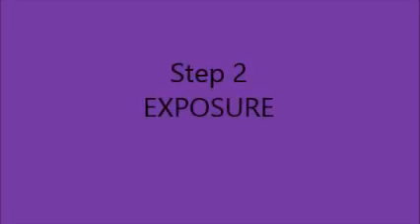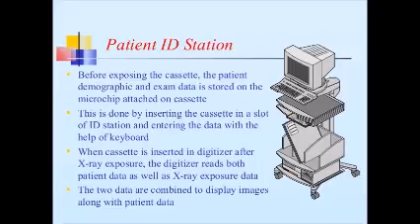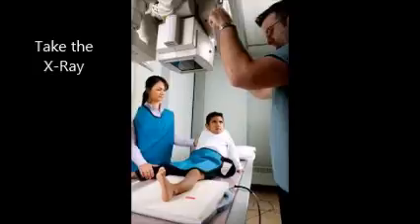Step number 2, exposure. Take the picture on a CR plate. The patient is exposed using the correct kVp and mAs. It's very important to select the correct exam on the monitor before exposing the patient. And remember to always shield your patient.